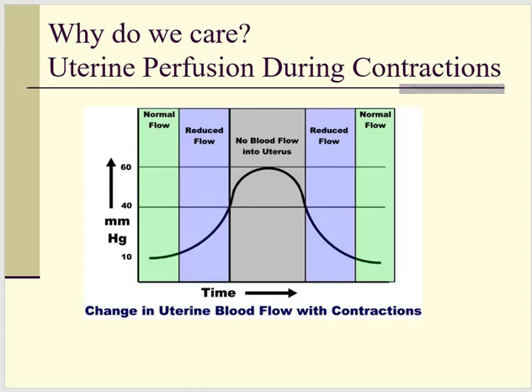Fetal heart rate monitoring is basically to make sure our fetus is handling contractions well. To see if our fetus handles contractions, we have to be able to accurately assess and quantify the contractions. When you're looking at your fetal heart rate monitor, it's a big picture, both the fetal heart rate and the contractions together. Don't get so caught up on the heart rate that you're not looking at the contractions.